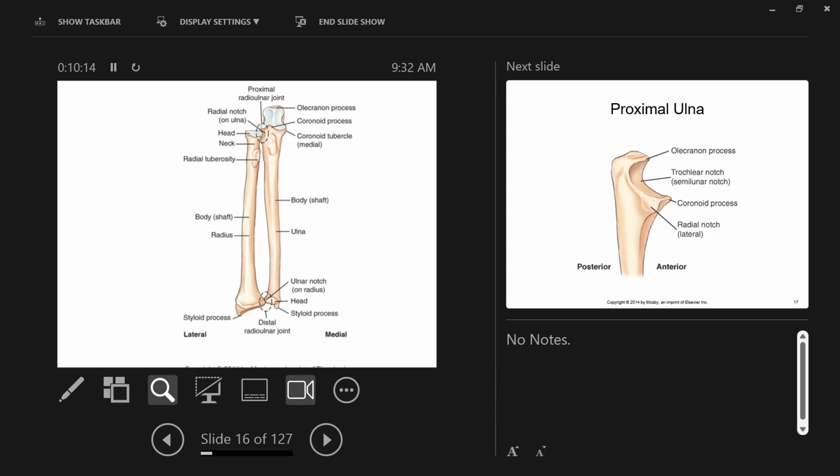If you'd like to come up and look, you're welcome to. But you'll notice down here, this is a lateral elbow, I put it the wrong way, it looks like there's a break in the bone here, right? Like a big dark line running right through here. Like, man, that kid broke his elbow, right? No, this is just an open growth plate or epiphyseal plate. This person is a child. This is my cousin. He was 14 when he did this, and this is after reduction, so you're not going to see any pathology here.